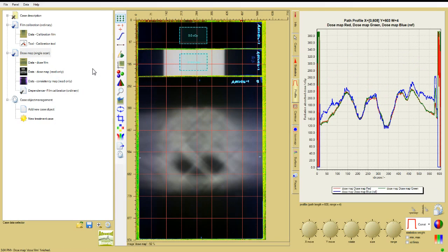The red-blue dose map is essentially the same as the proposal we made several years ago to do dosimetry using the ratio of red and blue responses, wherein the response of the blue color channel provides a correction for small non-uniformities in the film, as well as for certain scanner artifacts.